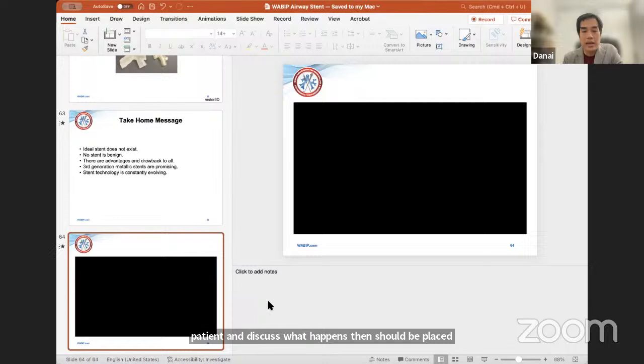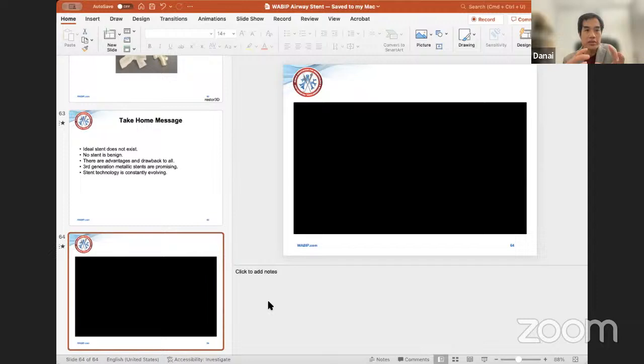Yeah, I think that at the VCU DM practice, we have the same protocol as PI DMC to do the stent trial. And once the patient feels better in 2 weeks, short term, we check the PFT, six-minute walk test, and all the objective parameters. And then once the patient feels better and objectively better, we'll send the patient for surgery.